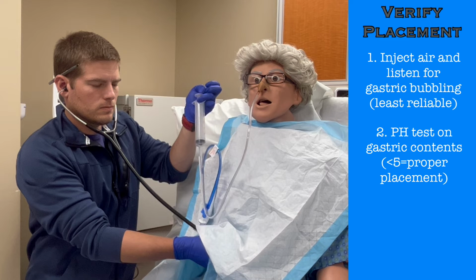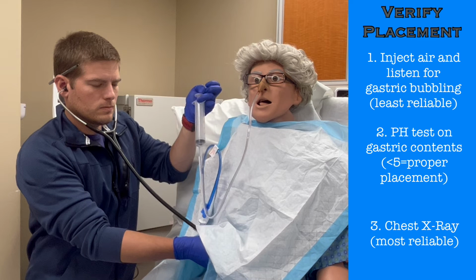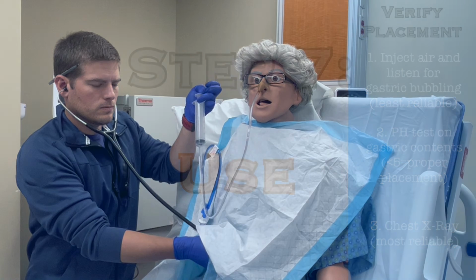The most reliable form of verification is to obtain a STAT chest X-ray. It can be performed at the bedside, so it is often ordered as a STAT portable chest X-ray. The X-ray will definitively verify proper placement of the tip of the NG tube, and you can confidently utilize it for treatment. Most practitioners will listen for bubbling to get a good idea if they were successful, and then utilize one of the more reliable tests to verify placement.